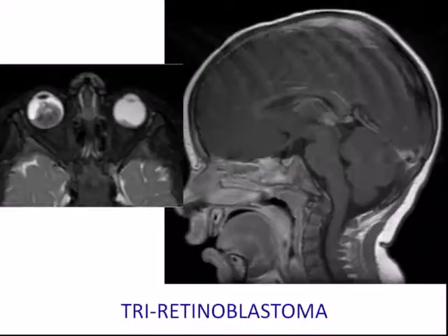This was an interesting case, bilateral retinoblastoma with a pineal lesion. What I have found useful is to always look at the T2, because sometimes on contrast, a pineal cyst can fill with contrast and look solid, and you really need to confirm that on T2, especially if you're going to send them in to actually take the lesion out. This was an example of a trilateral retinoblastoma.